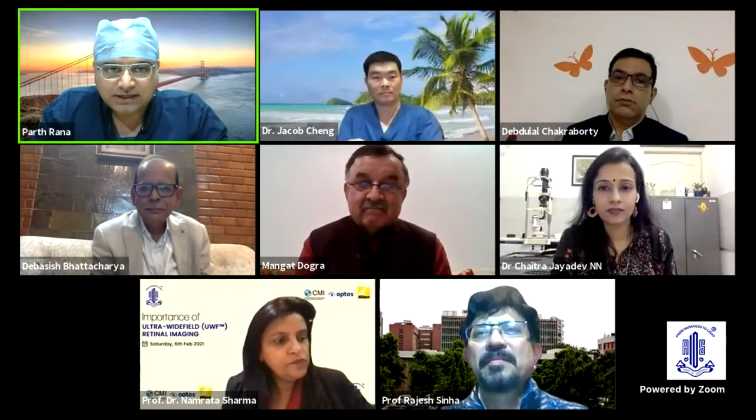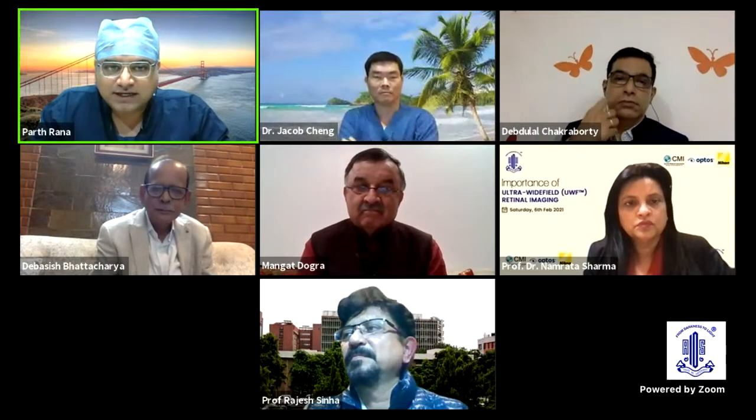In the latest Optos software, there's an option called montage. Sometimes the superior and inferior images are not proper, but if you go for a montage, we can see even the superior and inferior images. Some of my colleagues here in Ahmedabad and some seniors have made it mandatory. Before LASIK surgery, before the patient comes here, they do this montage imaging. We just see the montage and send the patient back. This is a routine practice right now here in Ahmedabad.